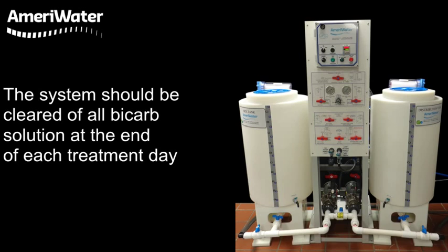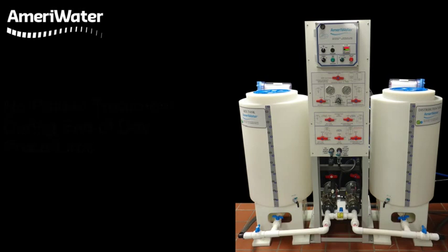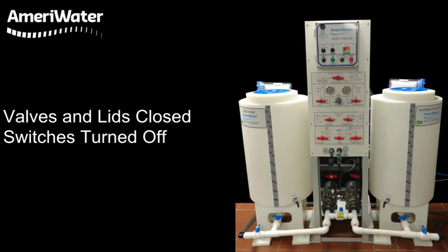The bicarb system should be cleared of all bicarb solution at the end of each treatment day. There should be no patient treatment during the end-of-day procedures. Make sure all valves and lids are closed and all switches are turned off.